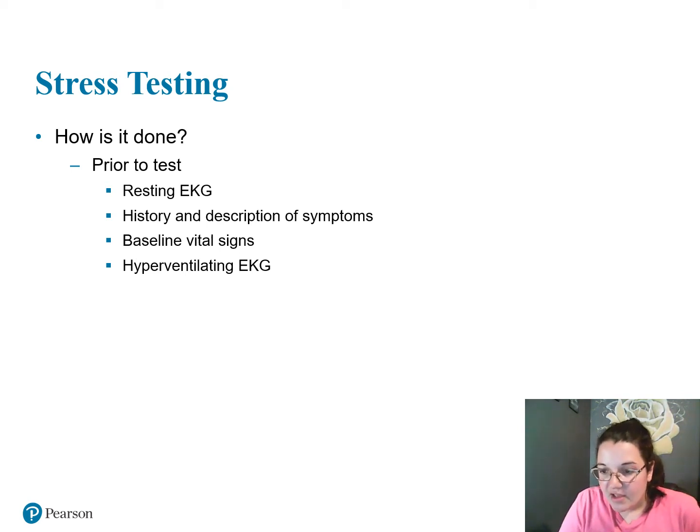If you have a healthy individual and they want to have a stress test, can they go get a stress test? No. You can only get a stress test if you have a history and description of symptoms. Baseline vital signs have to be taken before doing your EKG, stress test, and hyperventilating EKG.